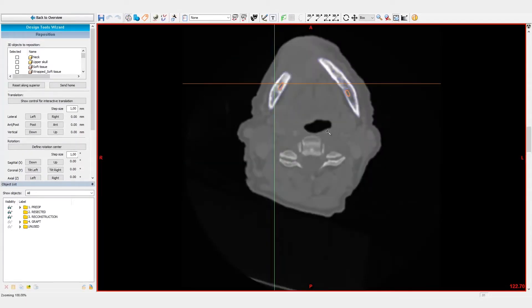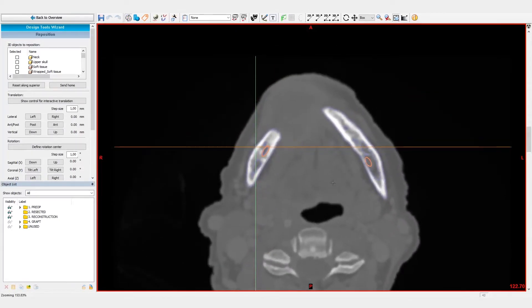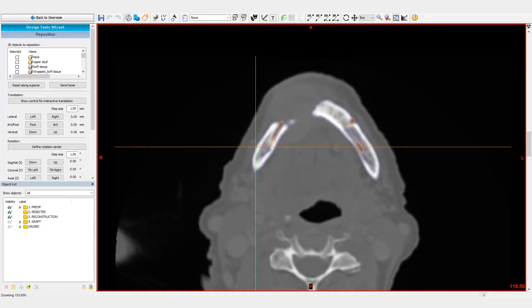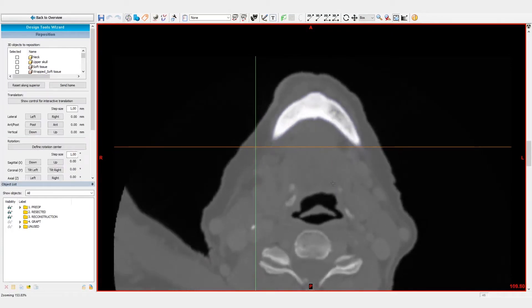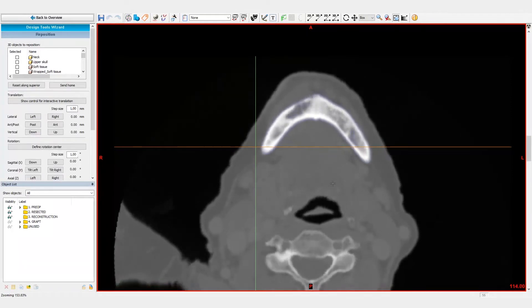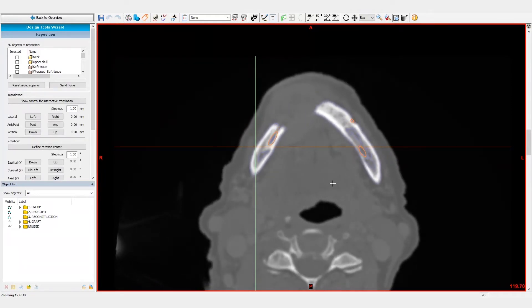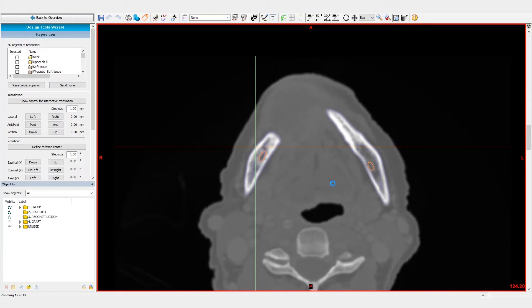The skull segmentation has been performed in the 'How to segment a skull in Mimics Imprint' video. After the segmentation, we've obtained two separate 3D models from the CT images. We will follow the following workflow for the reconstruction.